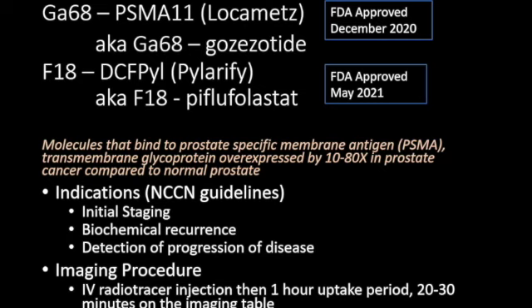The imaging procedure is similar to other PET scans in that the patient receives an IV radiotracer injection and then has a 1-hour uptake or waiting period. The time on the scanner is typically 20 to 30 minutes.